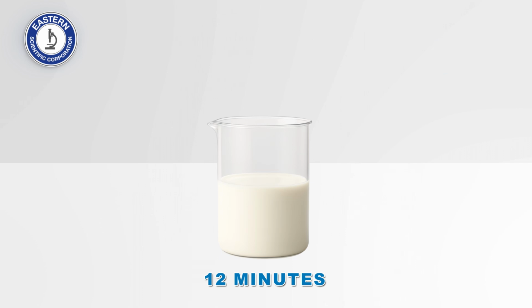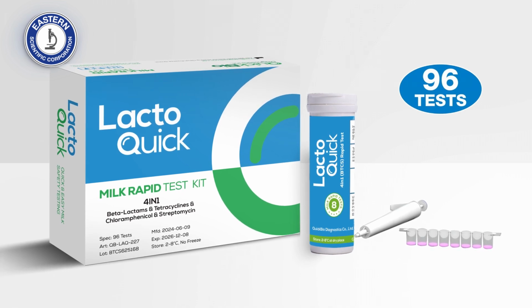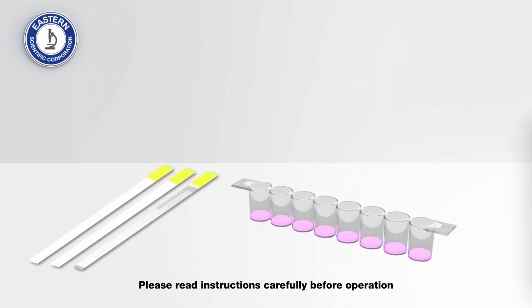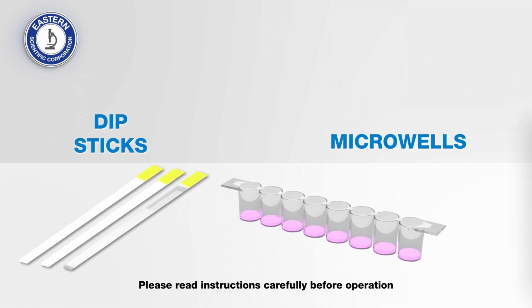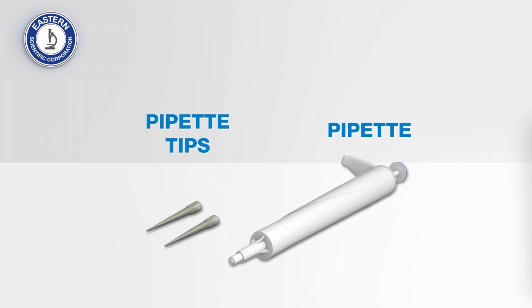The milk may be raw, pasteurized or full cream milk powder. 96 tests can be conducted using this kit. It contains 12 test tubes, each with 1 strip of 8 red reagent microwells and 8 dipsticks. 1 pipette and 100 pipette tips.